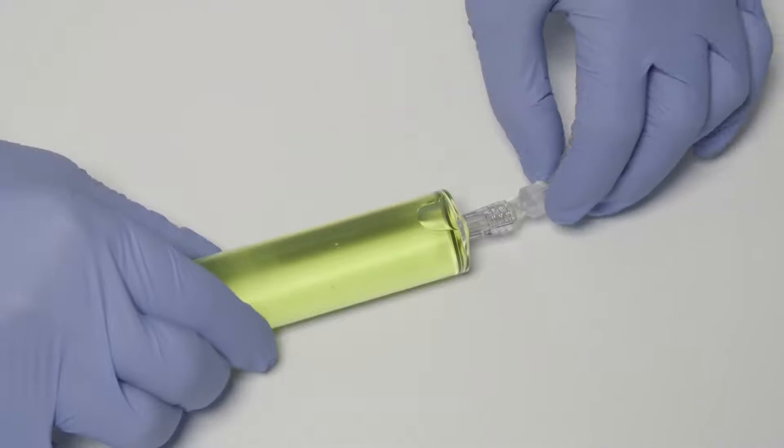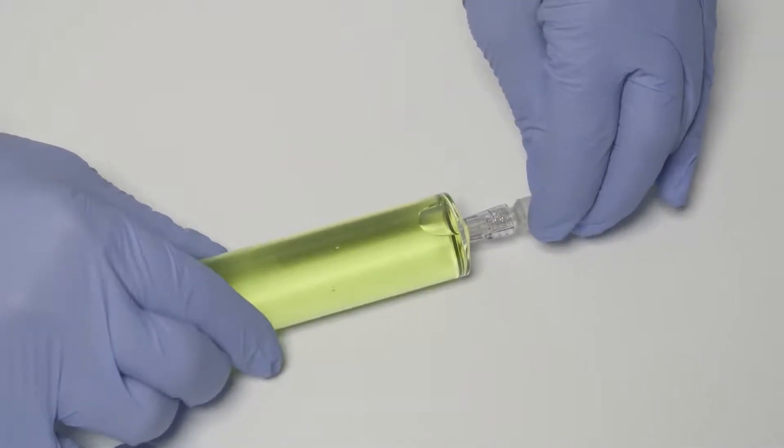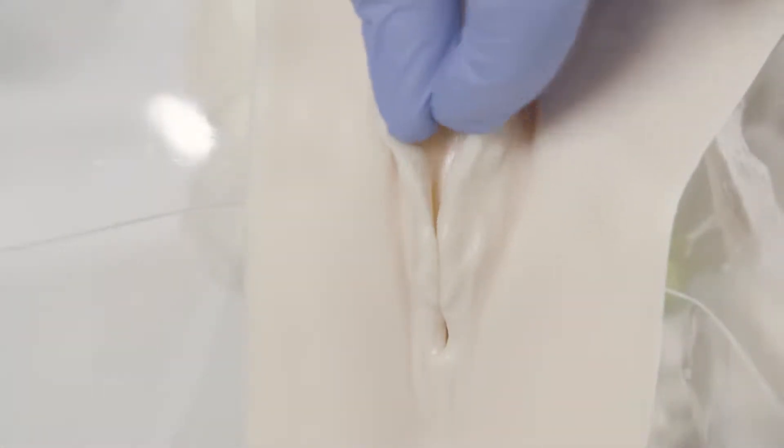After disinfection of the external urethral meatus, I open the labia gently with the fingers.